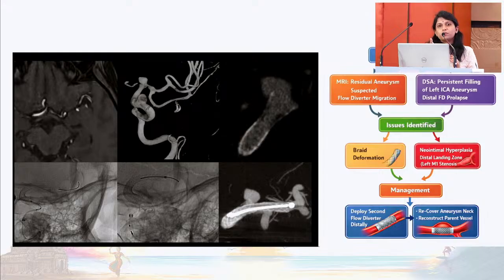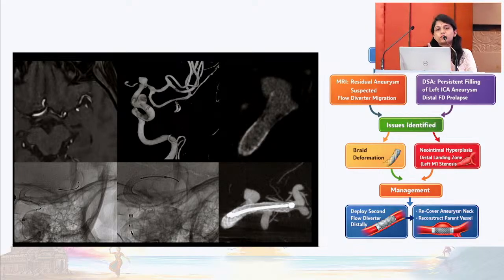But that happened because of the FDBD, flow diverter braid deformation. This was in the follow-up, and it almost prolapsed into the aneurysm. It prolapsed into the aneurysm. It was like the flow was diverted into the aneurysm, and neointimal hyperplasia occurred in the segment which was not opposed, because of non-opposition, which was due to braid deformation. Right, right. So yeah, but all the cases are very nice.